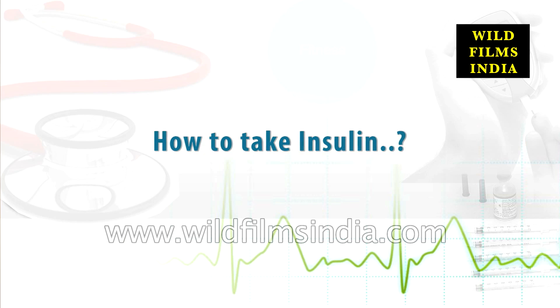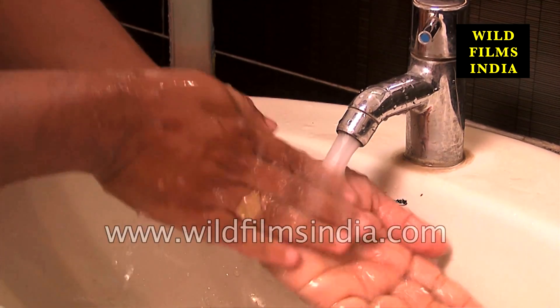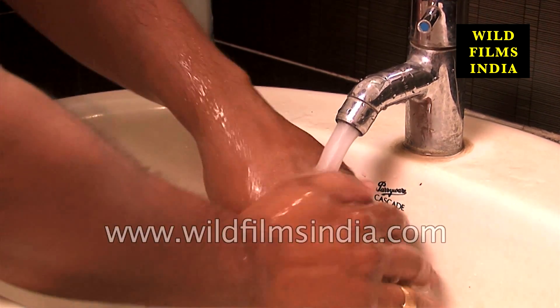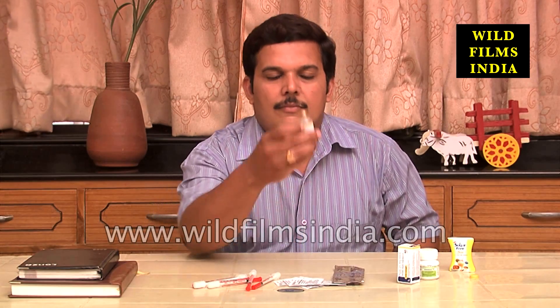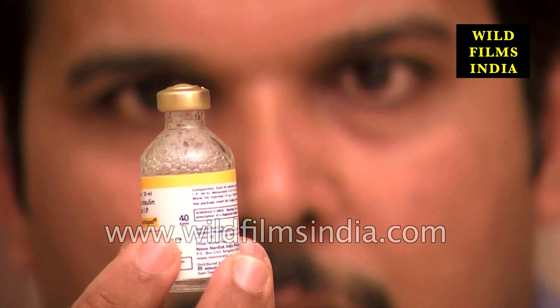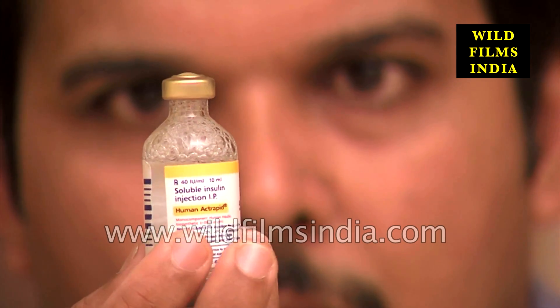How to take insulin. Before preparing your insulin dose, thoroughly wash your hands using soap and water. Prior to drawing your insulin, inspect the vial. Check the expiry date and any signs of insulin breakdown within the vial.